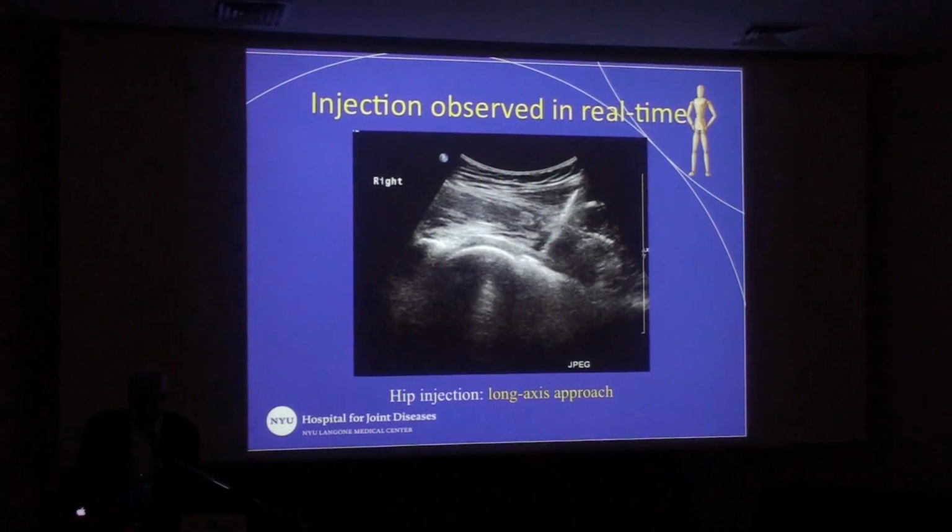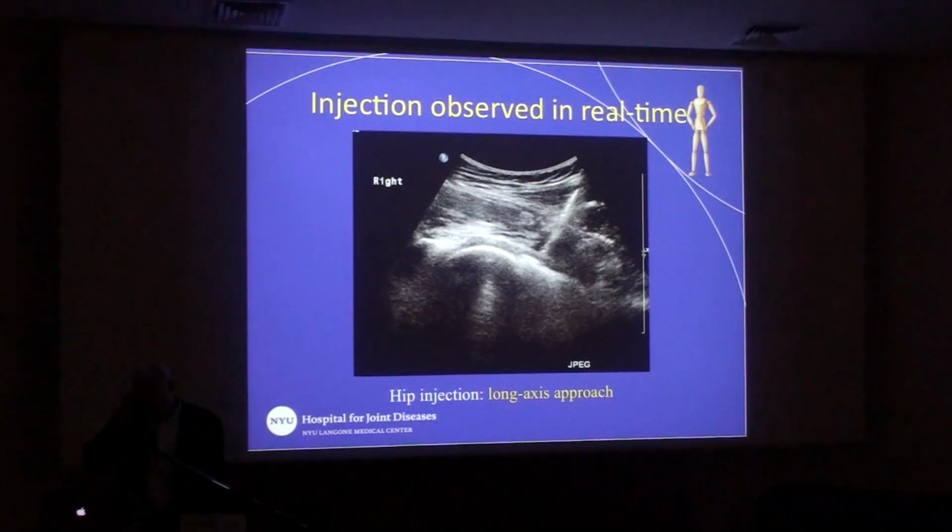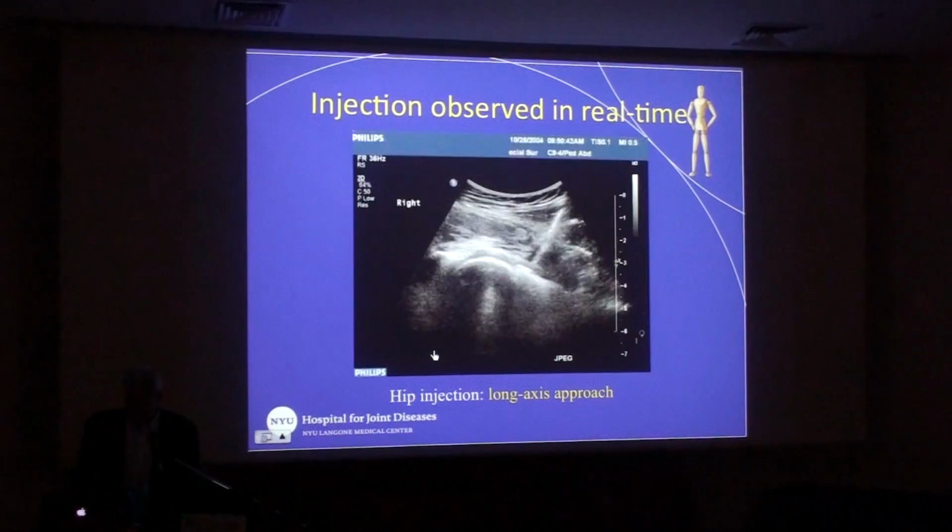And of course, injections are always performed in real time. That's one of the beauties of ultrasound, so we can always monitor the material as it goes in. Let's hope this works. There we go. So you can see distension.